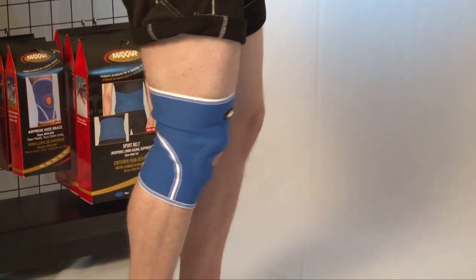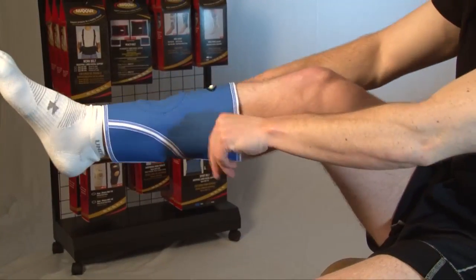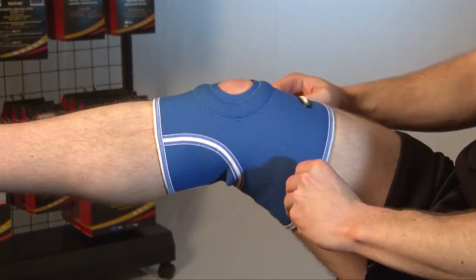Unique AirPrene, which is a breathable neoprene construction that allows air circulation. This minimizes skin irritation and allergic reactions, making it comfortable to wear for long periods of time, even in hot weather conditions.